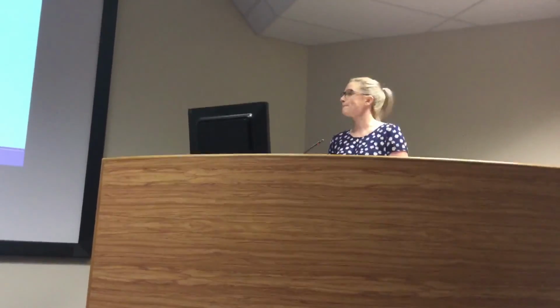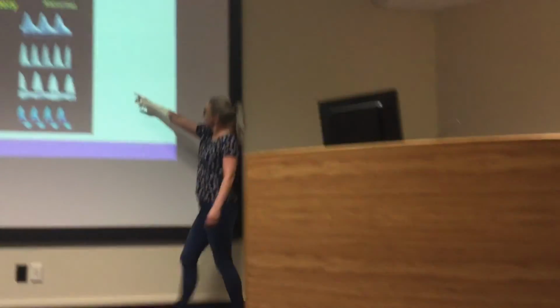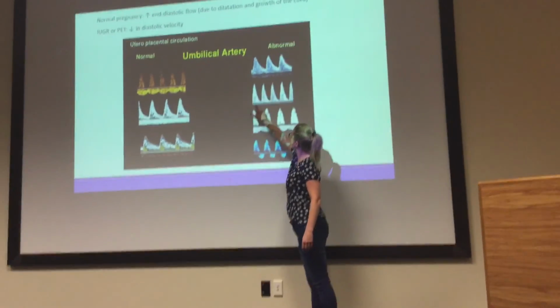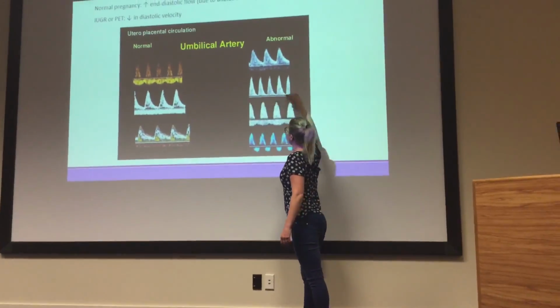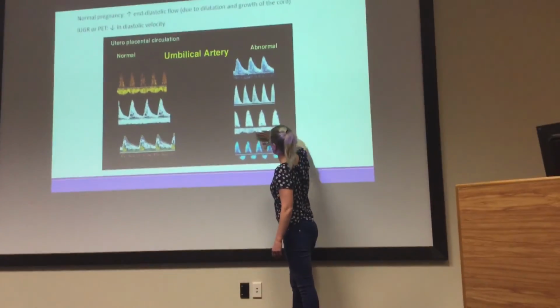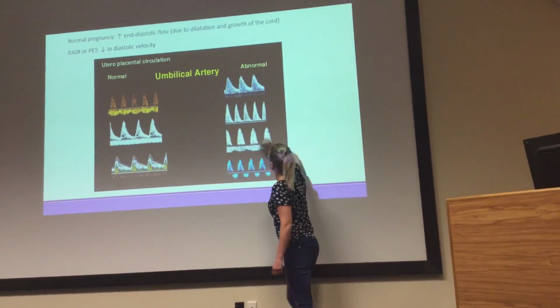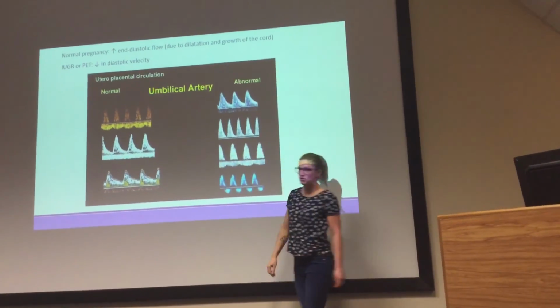So Rachel, you see the second one down where it's just a line underneath it? This one here? Yeah. Is that line the... No, that's just a line that happens to track. We would still see the vein sort of being underneath there. It just isn't in the picture, but yeah, that's fine. Just the image that I could find.